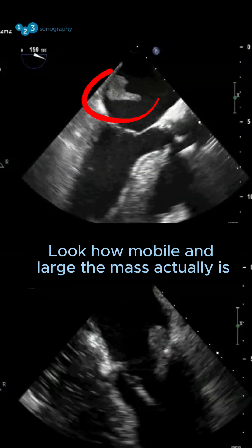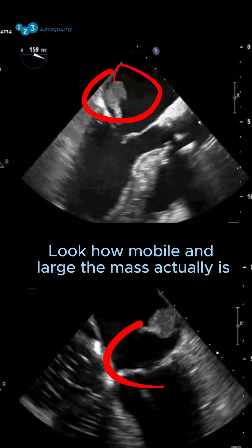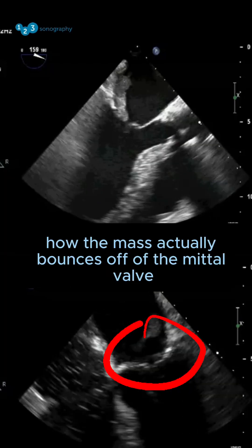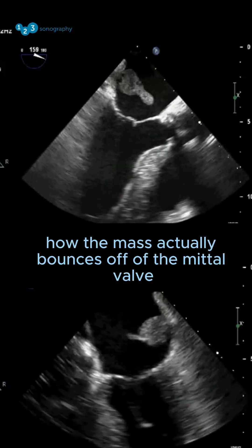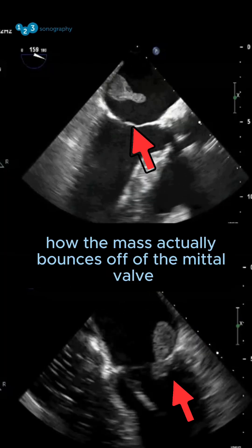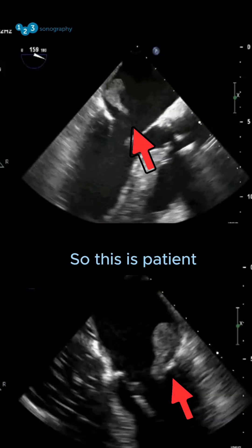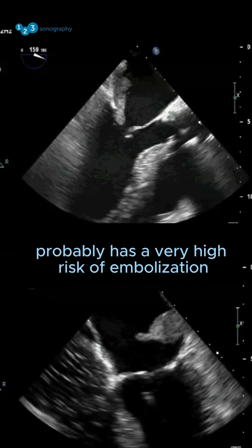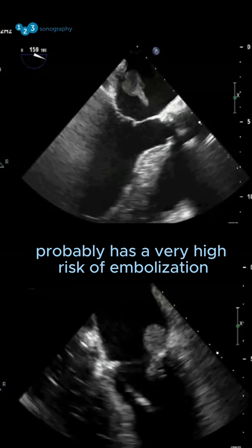Look how mobile and large the mass actually is. Note how the mass actually bounces off of the mitral valve — this patient probably has a very high risk of embolization.